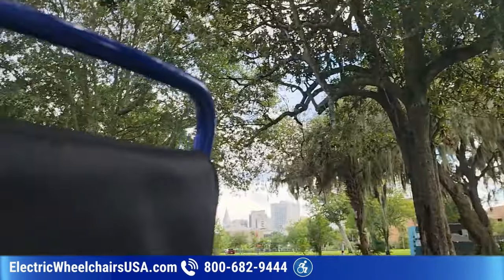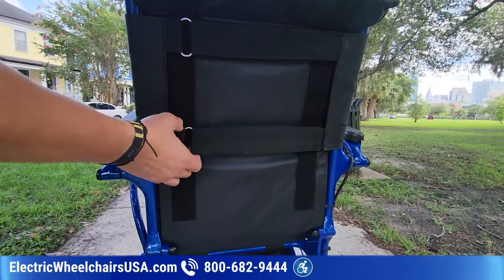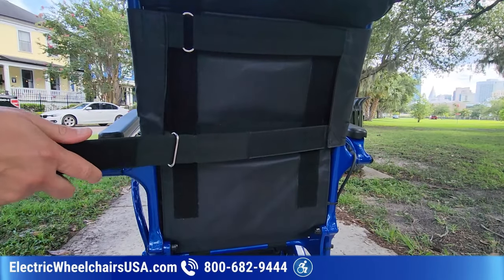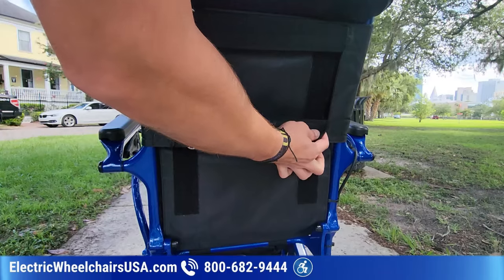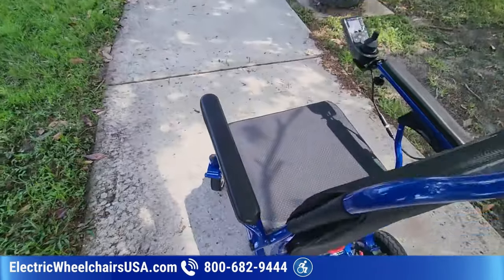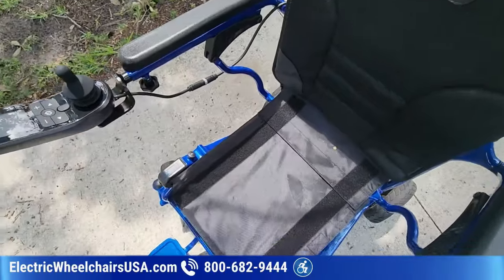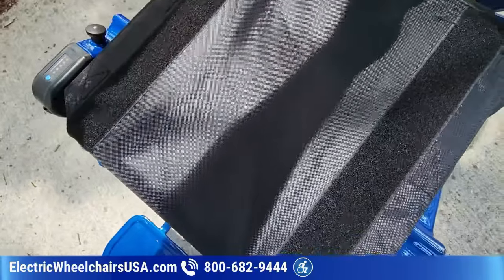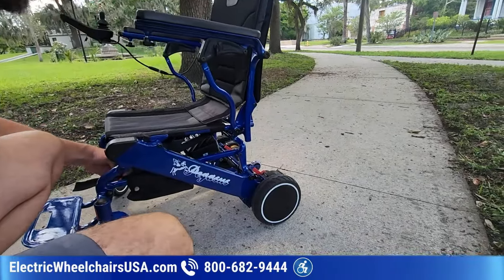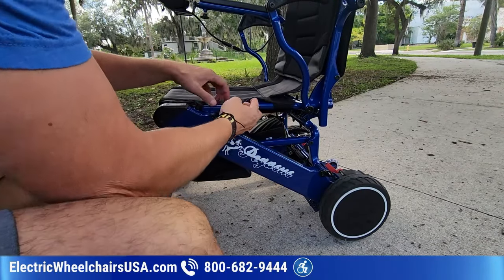Also on the back, I'll show you. I think this is a pretty cool feature. So if I remove this cushion, you can see there's these straps here. So I can make this loose, or I can make this really tight to give you some support on your back. And same thing on the seat. So if I take the seat cushion off, you have some straps here as well. So we got some straps here too that you can tighten and essentially do the same thing.